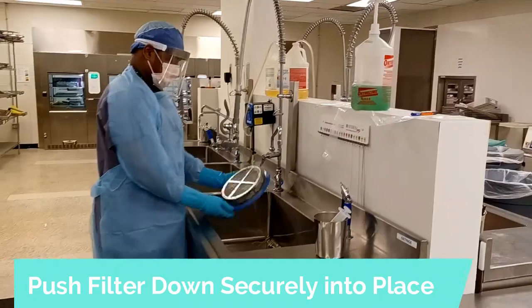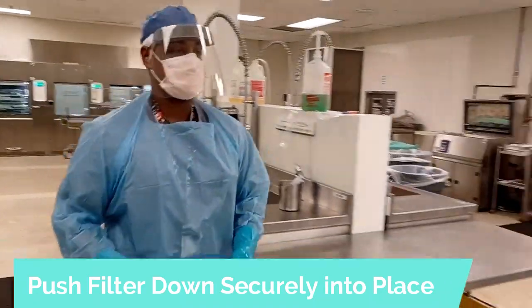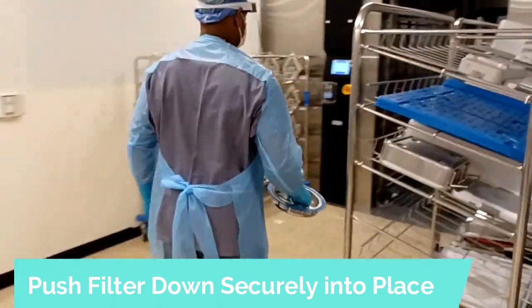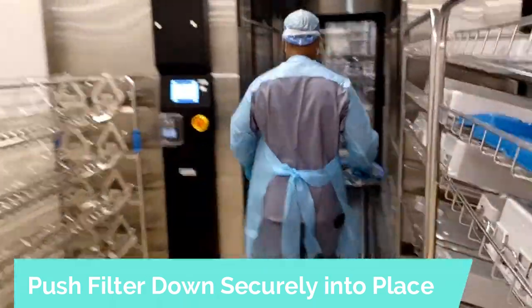Remember, when returning the filter back to its place, make sure you put it in position and push it down securely to make sure it holds.